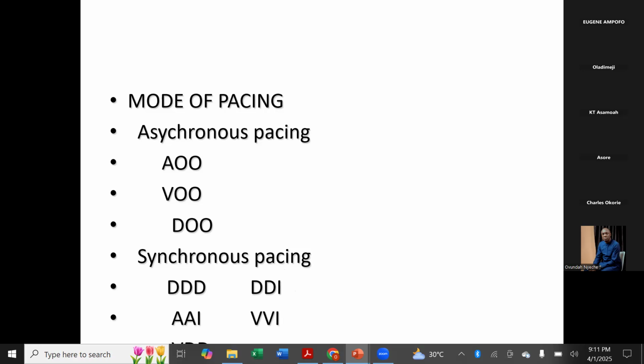You get that? So the atrial rate can run at 250, 300, 350. It will not bother you because the ventricle will never go beyond the rate at which you have set it. At that time, it will switch from following the atrium. It will now just be pacing its ventricle at its ventricular set rate. Do we get that, sir? Yes, Prof. So I just want us to see the little minute difference between a DDD and a DDI.